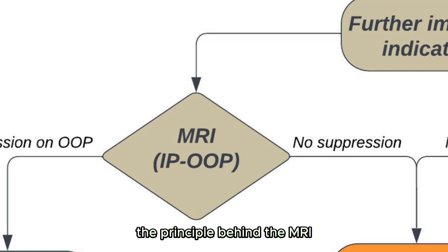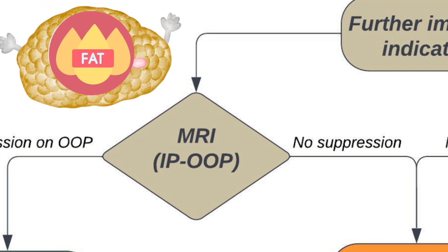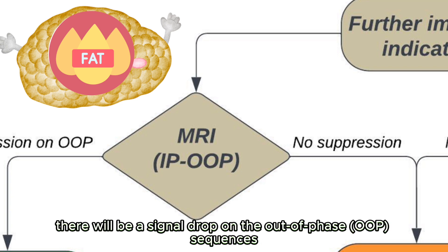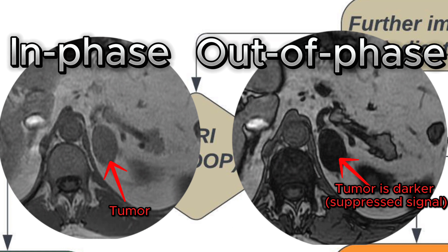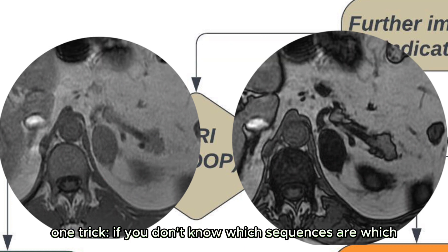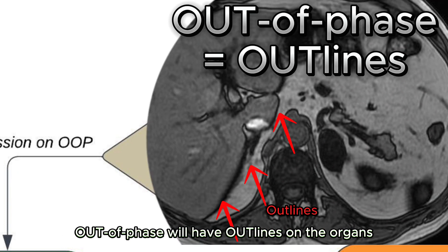The principle behind the MRI is that adenomas will contain intracytoplasmic lipid, which may be undetectable on CT. If the lesion contains fat, there will be a signal drop on the out-of-phase sequences compared to in-phase. One trick: if you don't know which sequences are which, just remember that out-of-phase will have outlines on the organs.